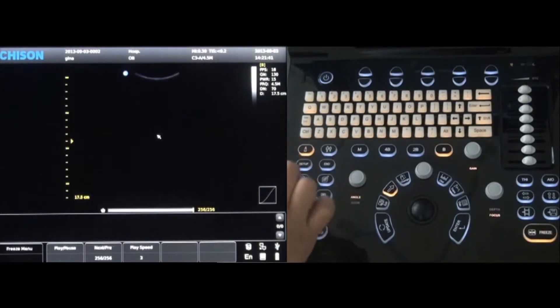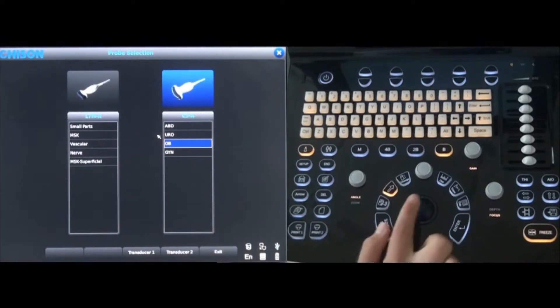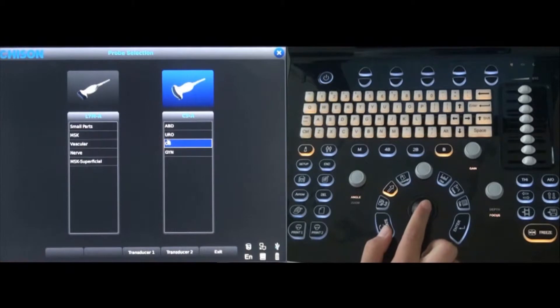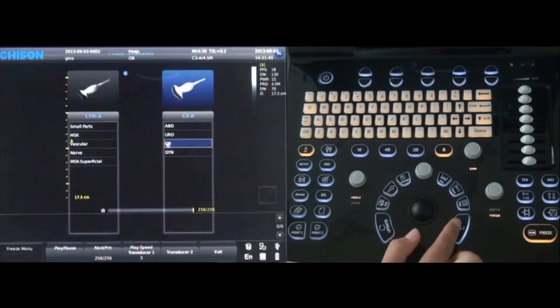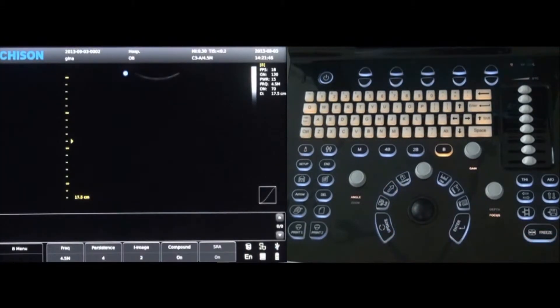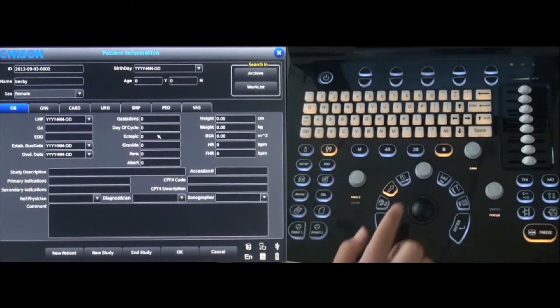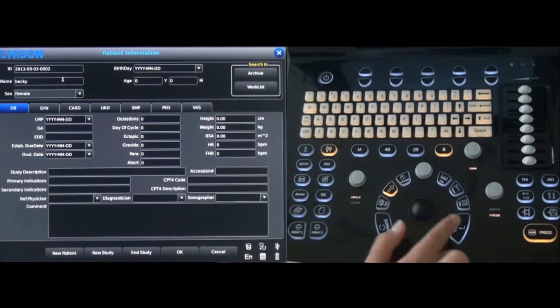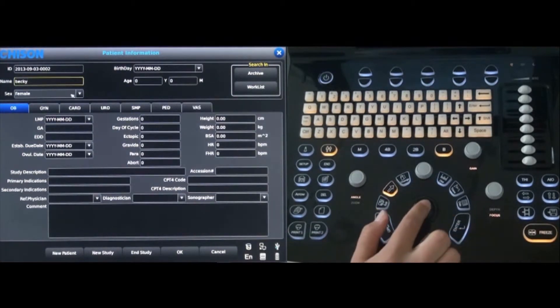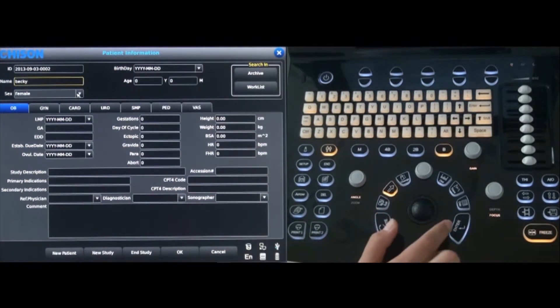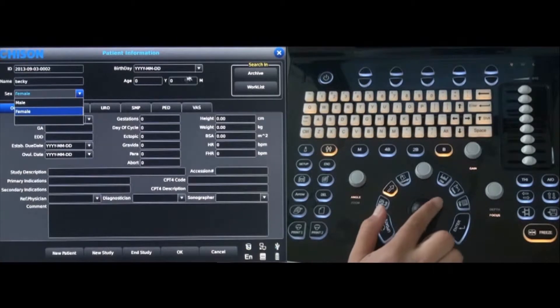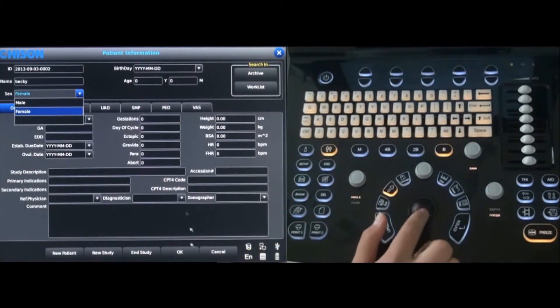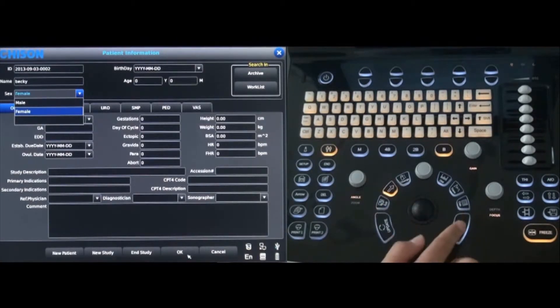Press the probe key to view the probe selection screen to choose the correct probe and application that is needed. To create new patient information, press the patient key next to the probe key. Fill in the patient name, gender, and birth date, and select the OK button when finished.